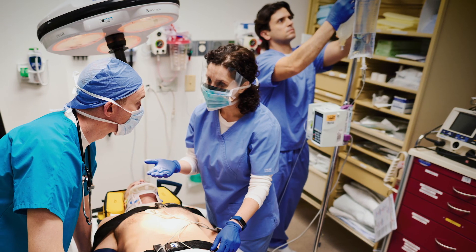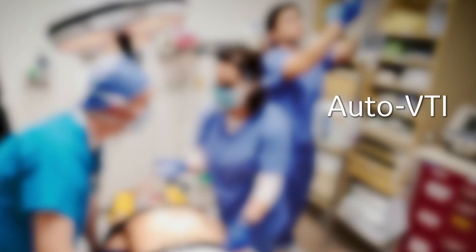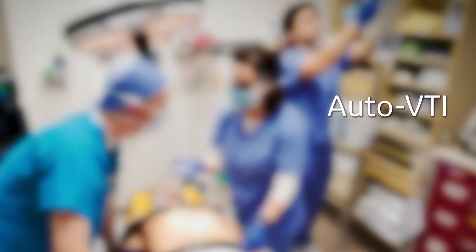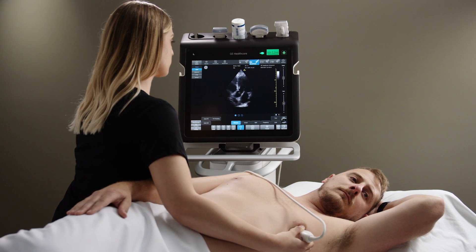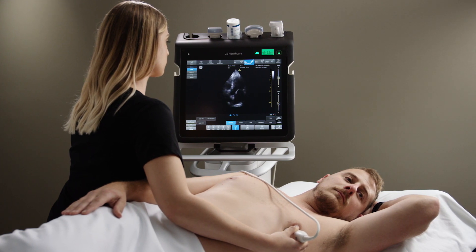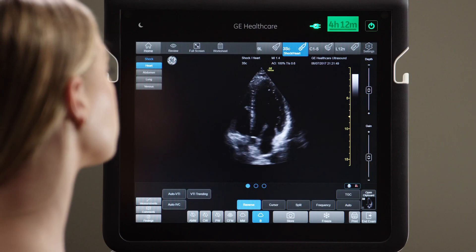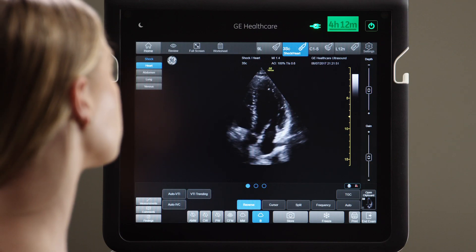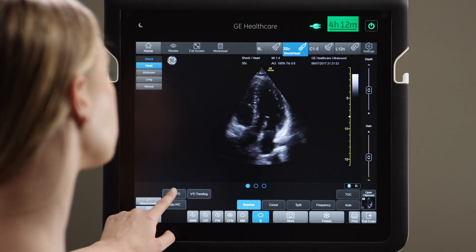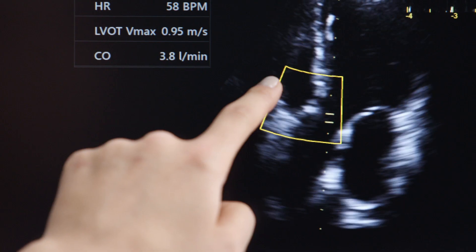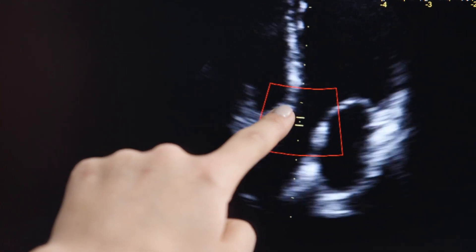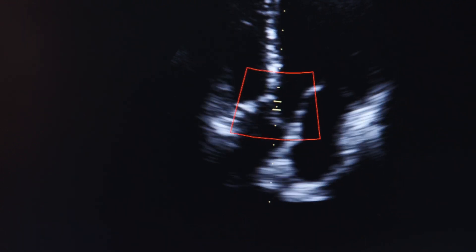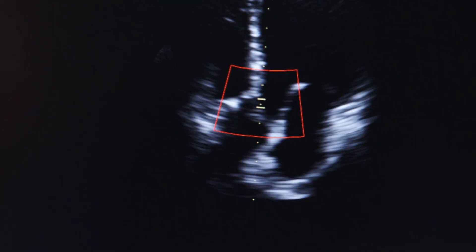You may want to know if the heart is pumping enough blood to end organs. When you use Venue and want to assess the VTI, find a 5 or 3 chamber view and press Auto VTI. If needed, optimize the position of the sample box over the left ventricular outflow track.